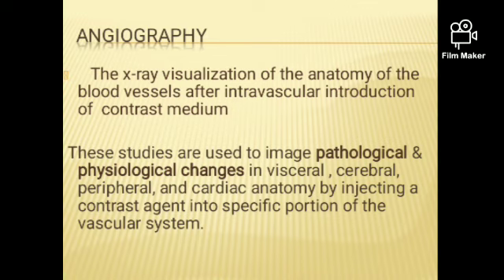Basically, contrast media must have a high attenuation number, or high atomic number, so that it is visible to us as a bright image. In X-ray and CT, we always describe the image based on density. The higher the density, the brighter the image. The lower the density, the blacker the image. Similar density means the same as the water level or soft tissue: grayscale, iso.